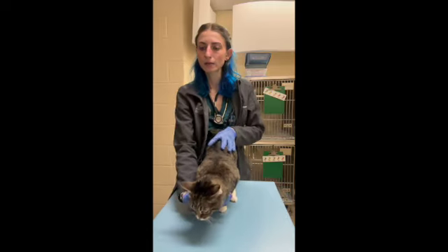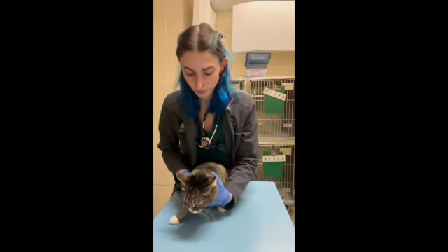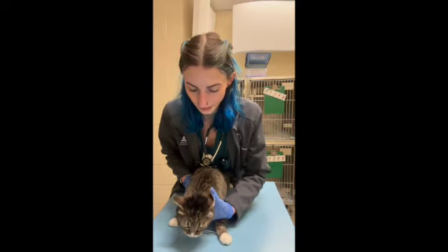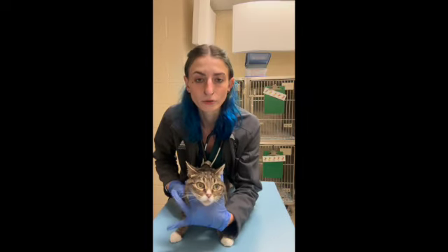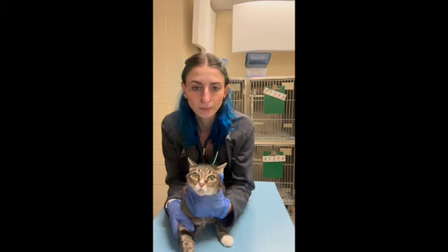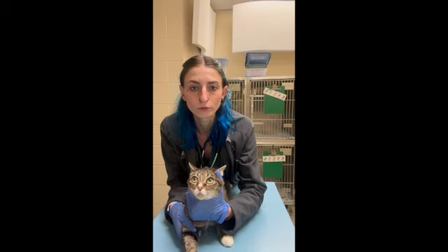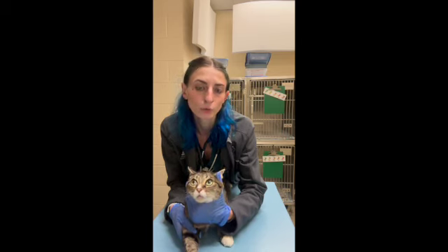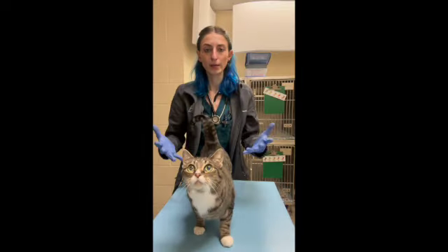In order to obtain a cephalic blood sample, I would sit my patient in a sternal position. Then, depending on which leg, I would make sure that I hold my patient under the chin, and then you want to extend the leg, hold off, and roll the limb. This would be another example of how to hold a patient for a cephalic blood draw. If the cat were to get unruly, then you could take a towel and wrap her up in the towel to secure her limbs. And so that could be a way.